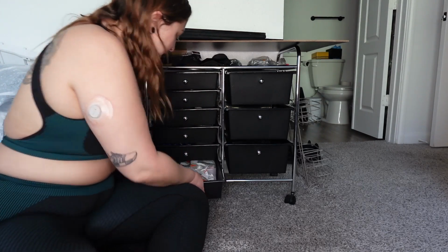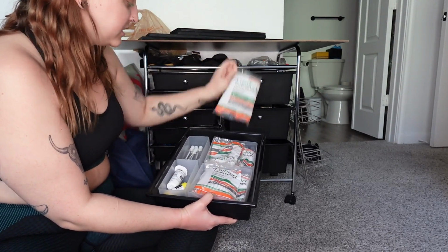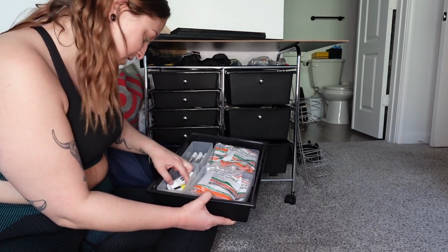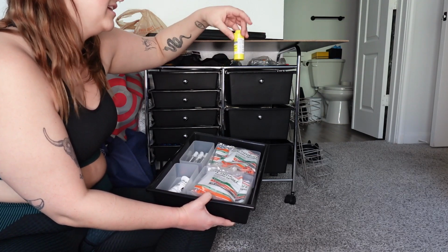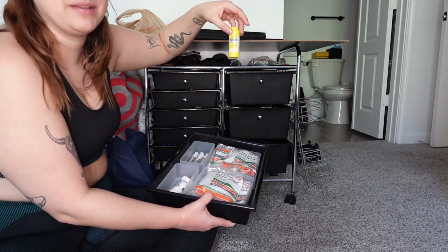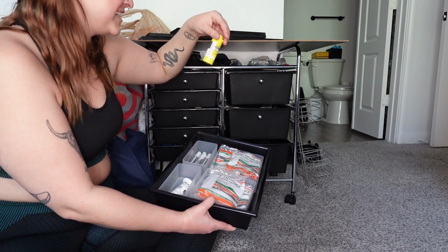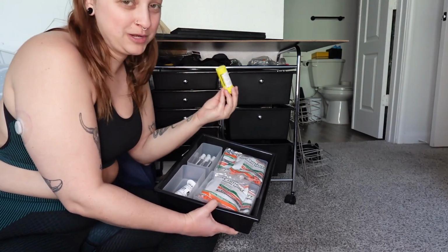And then the bottom drawer here is a bunch of insulin syringes. There's also ketone strips and an almost expired Baqsimi. I almost said Basquimi, which is like glucagon, essentially, but, you know, new age glucagon.